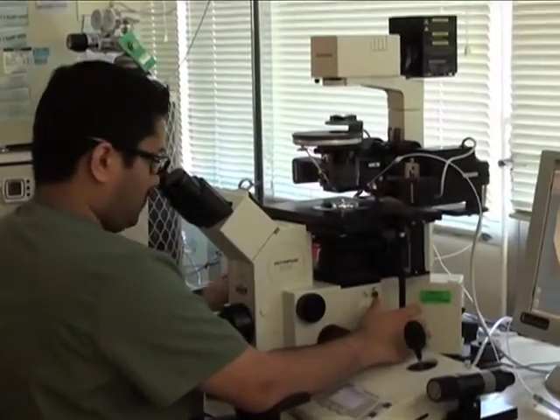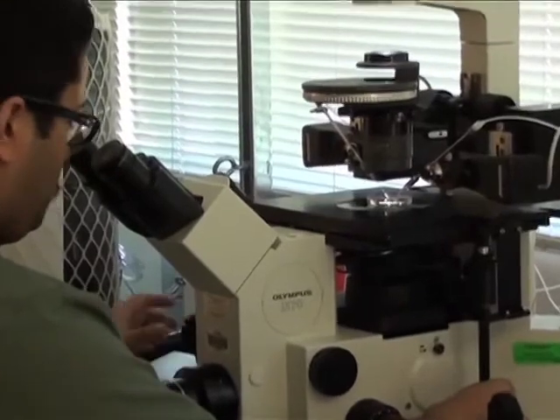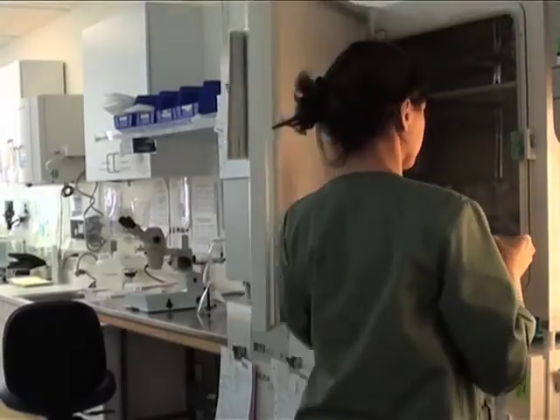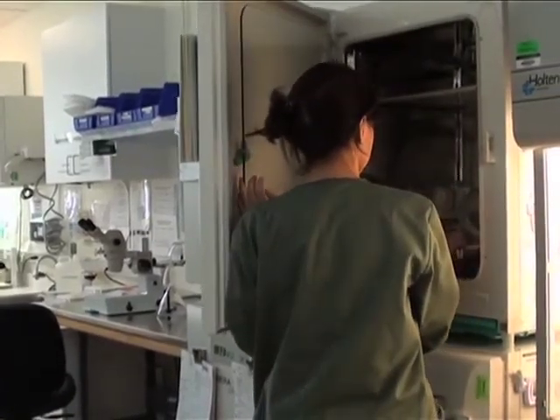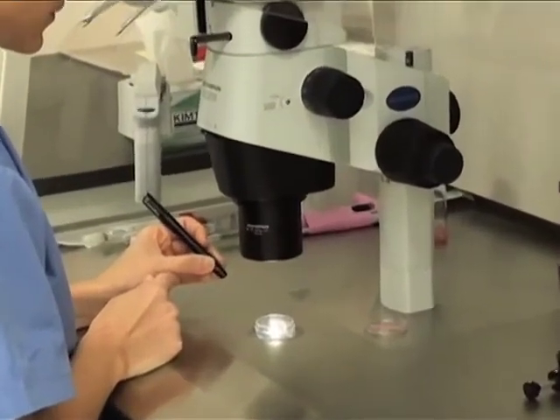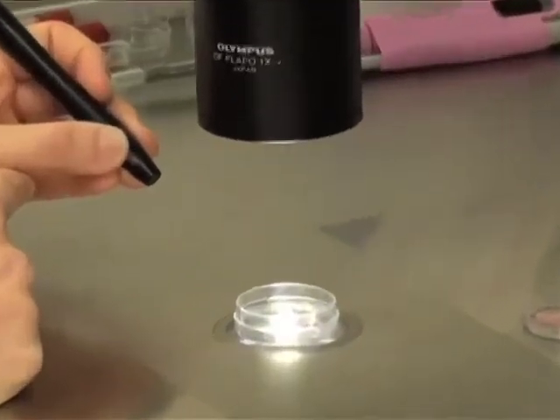Based on the identification of the 3 non-invasive cell cycle parameters that accurately predict blastocyst formation by the 4-cell stage of development and the development of automated time-lapse imaging technology just described, we propose the use of this novel technology which can easily fit into current IVF laboratory workflows.